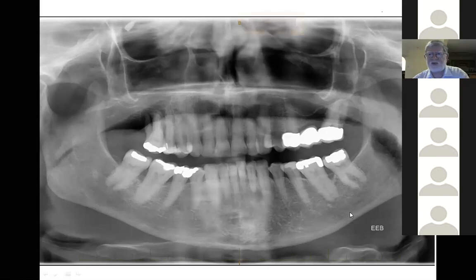Okay, 32, yeah, 32. When I see a patient as a new patient, I'll take bitewings and get an OPG done. When you're seeing something like this, because the vertebral column is superimposed over this anterior area, this is the tongue, the line of the tongue, by the way, all across here.